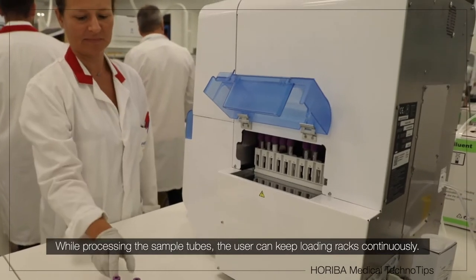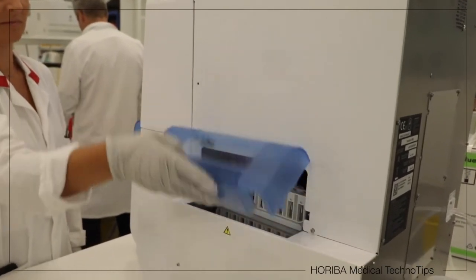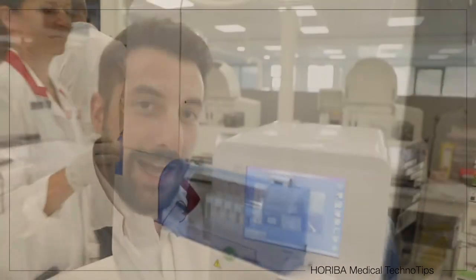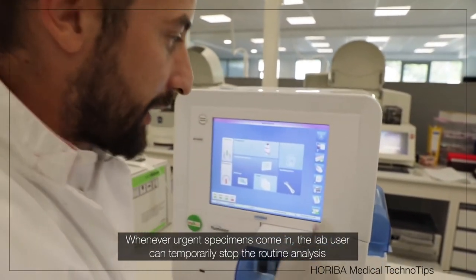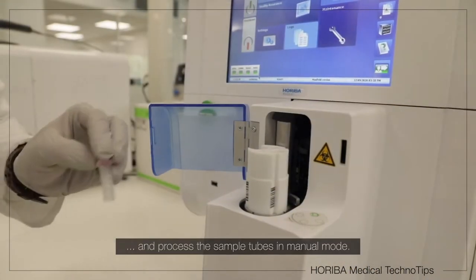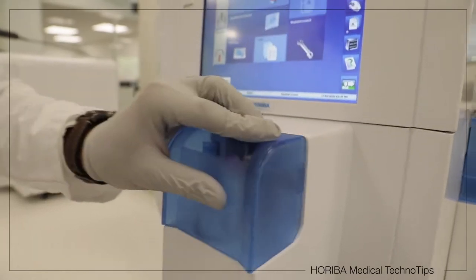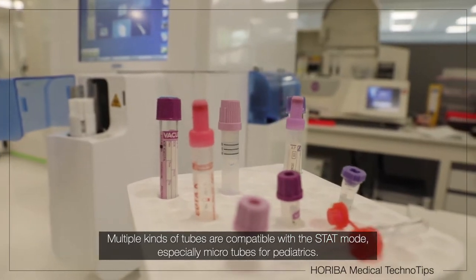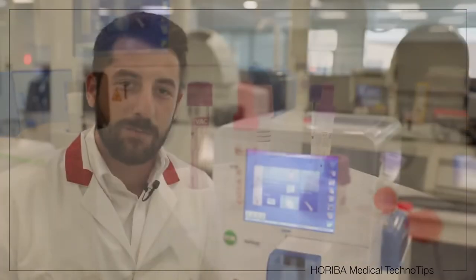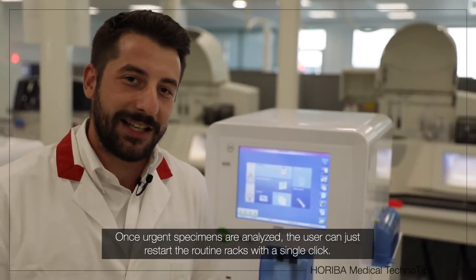While processing the sample tubes, the user can keep loading racks continuously. At any time, for urgent specimens, the lab user can temporarily stop the routine and process the sample tubes in manual mode. Multiple tube kinds are compatible with the STAT mode, especially micro-tubes for pediatrics. Once analyzed, the user can just restart the routine racks with a single key.